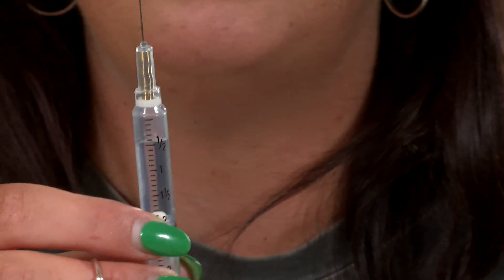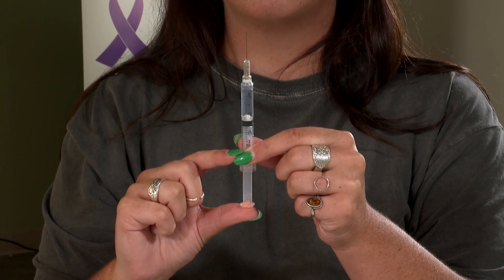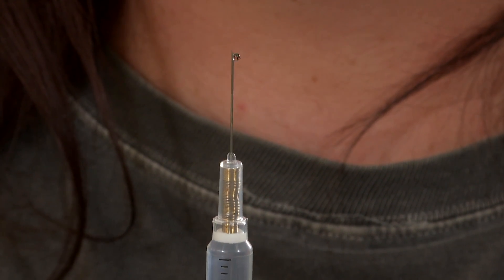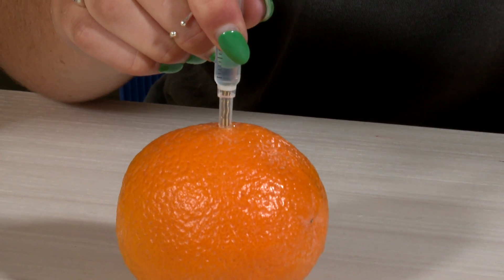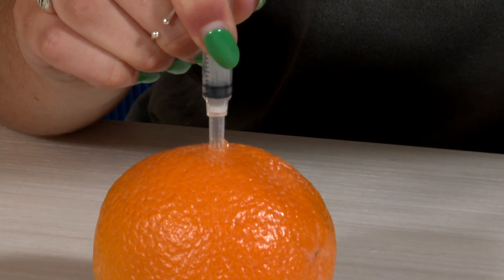Once your syringe is prepared, go to inject it into the individual who has apparently overdosed. You would pick a fatty, meaty area of their body — whether it be the side of their arm or the side of their thigh. Just plunge it into their skin. The needle can go through clothing, and then give the entire dose of naloxone at once.